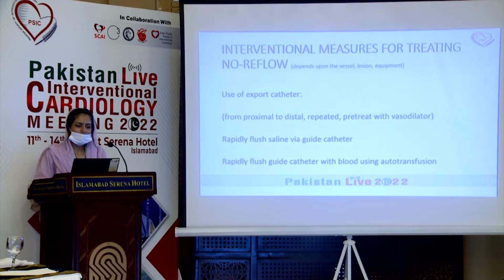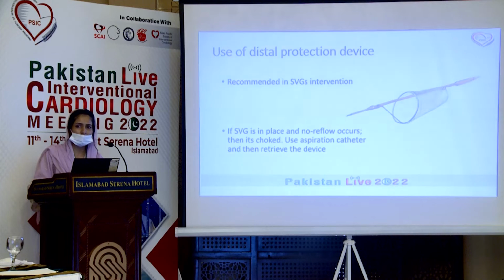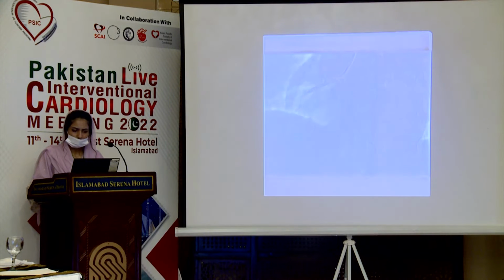Interventional measures for treating no reflow depend upon the vessel, lesion and equipment: use of an export catheter, rapidly flushing saline via the guide catheter, and use of distal protection devices, recommended in saphenous vein graft intervention. And here is the final view of our case after the pharmacological measures. There is good flow into the PDA and PLV, which is called TIMI 3.